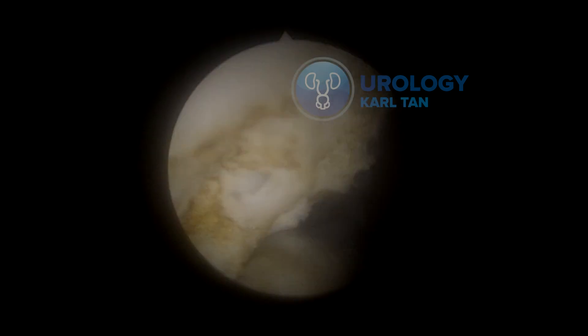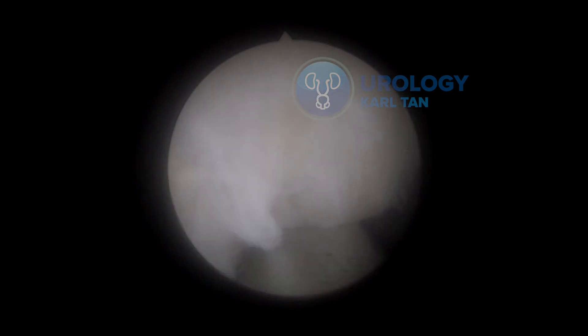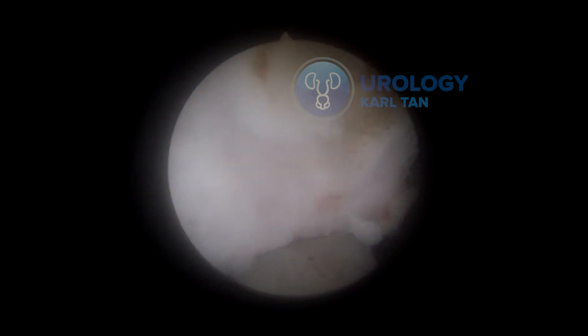However, in this case we are lucky to be able to remove the whole thing without any problem. You can see how clear our view is and we're not having any problems with bleeding — we can continue doing the morcellation without stopping. Just make sure before you start the morcellation that your flow and view are very clear, control your bleeders, take time to do hemostasis, and there'll be no problem.